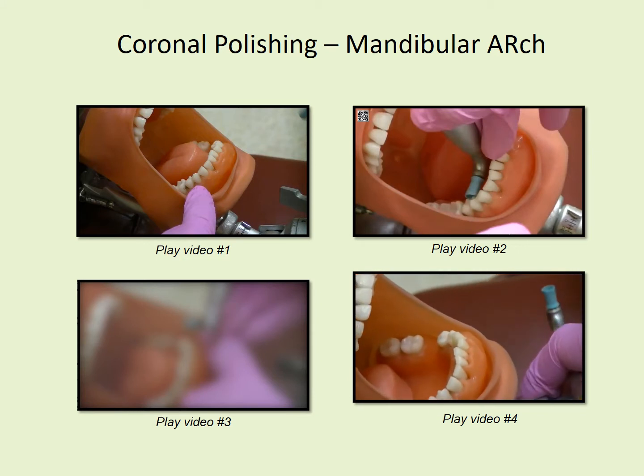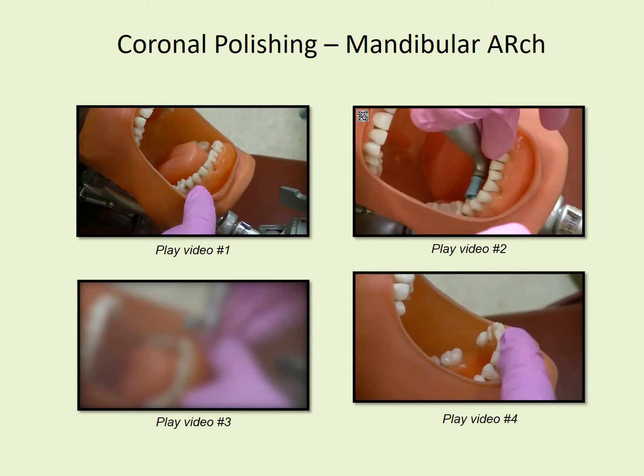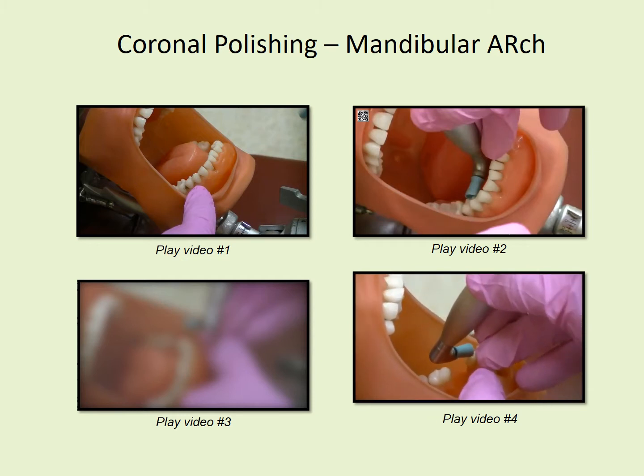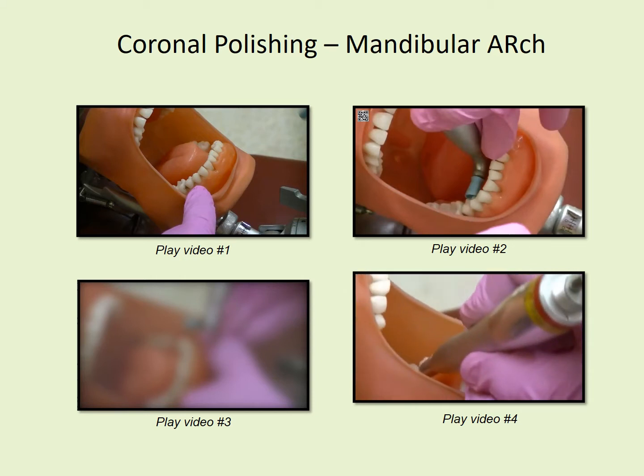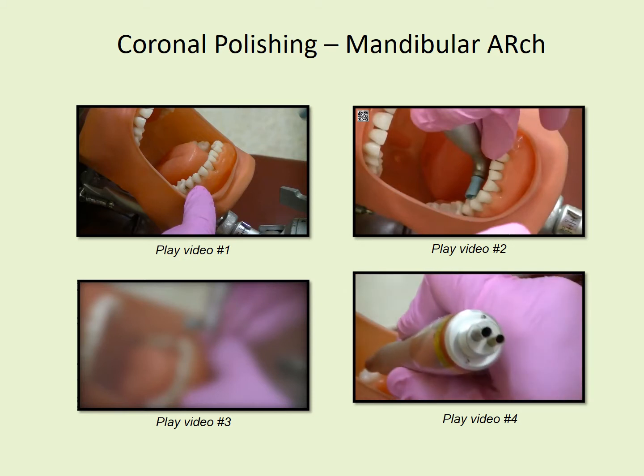And for those premolars, you may have to have the client actually turn a little bit more away from you to see, and you may have to slide your position forward a little bit, get your direct vision on those teeth.